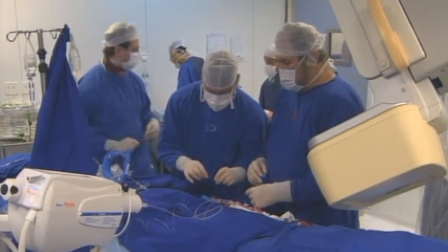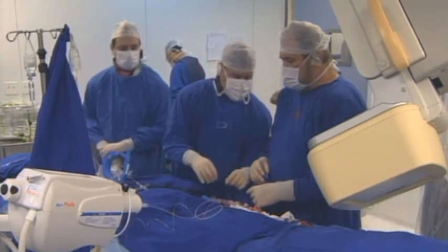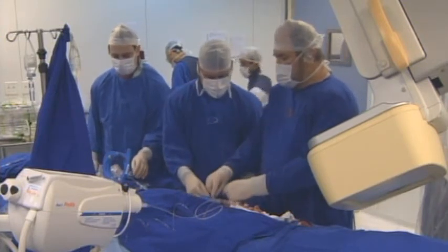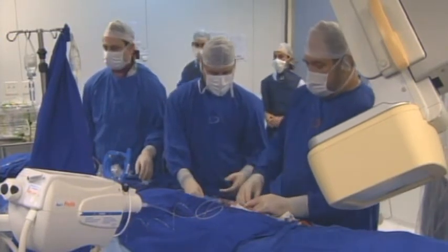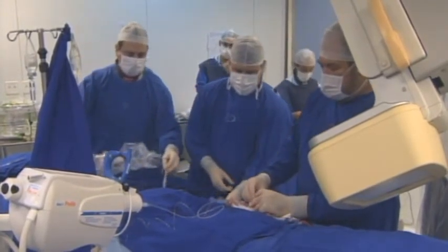Let me see what the audience has to say about this case, because it's SYNTAX score 31 and 5-6 stents. Put the lights up a little bit. Raise your hands if you would send this patient to surgery. With bare metal stents, there will probably be a consensus that most will consider surgery. But DES versus surgery in this case: SYNTAX 31 and a 75-year-old lady. We have to see if she's high risk for bleeding, because in a patient like that, I would give clopidogrel and aspirin for perhaps more than 12 months.